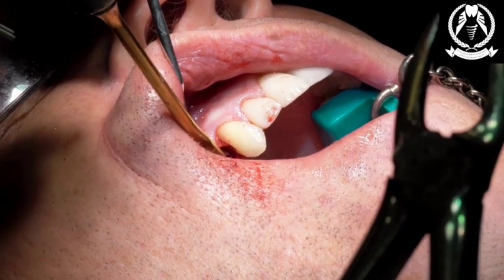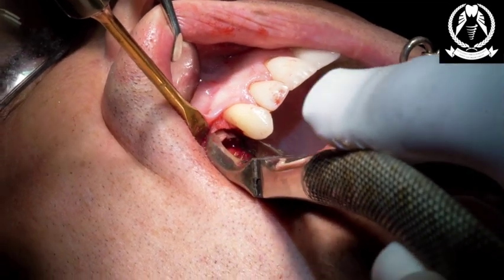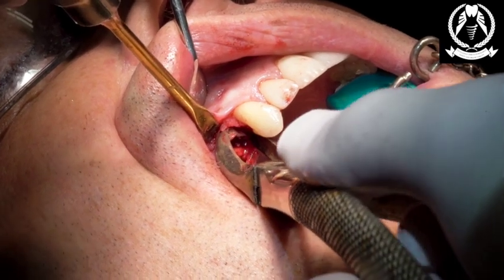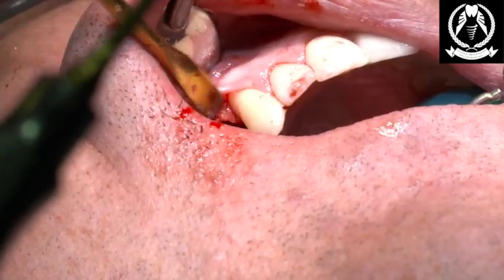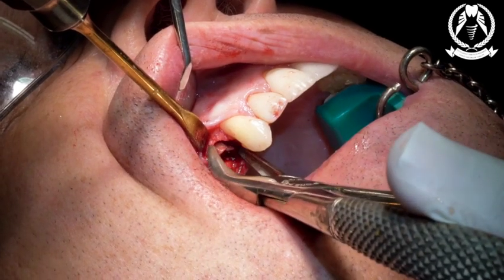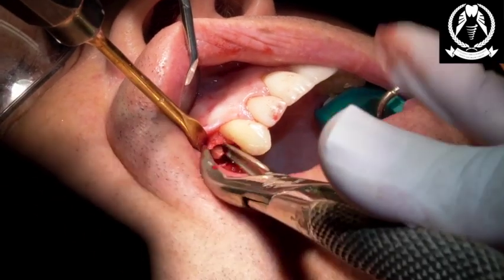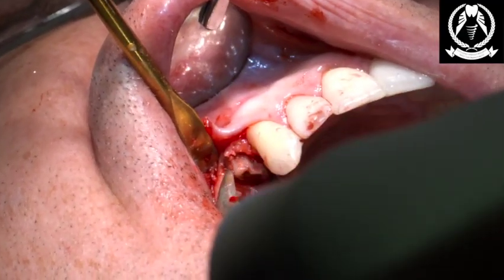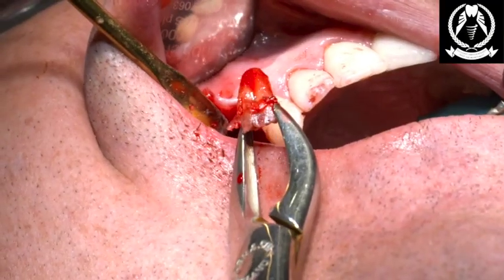Sometimes it does, sometimes. So you note the most important thing here is we're keeping that buccal plate. I need that. It just helps. And then we're just gonna. You got a finer forceps at all? Yeah. Give me the baby. Yeah, we have the babies. Might be able to tooth this in. And just hold it. There we go. And we kept that buccal pretty much intact. Can you see that? Okay.